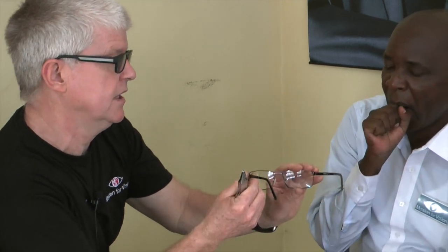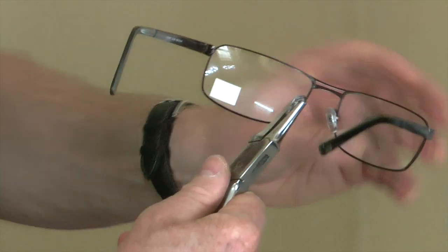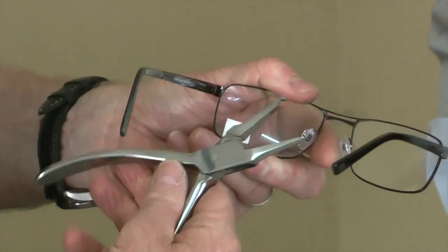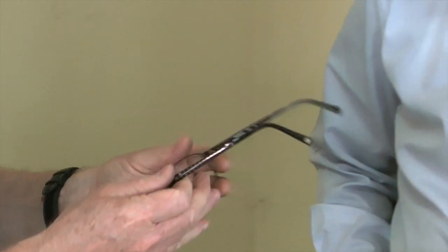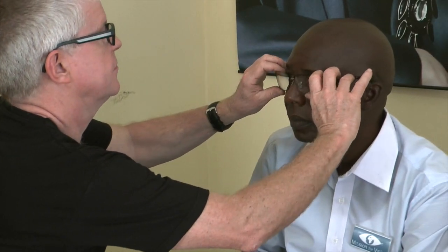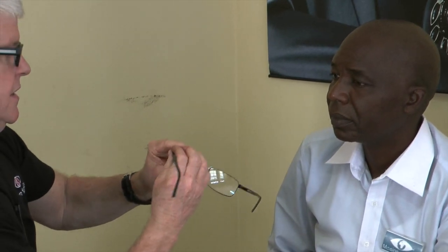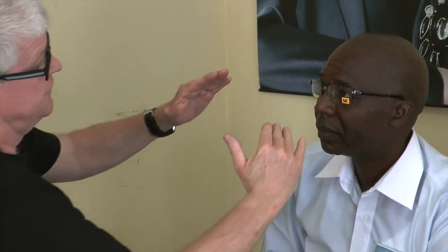So you can adjust the pad out and you can affect the angle of splay. The angle of splay is when you change the plane of the pad and you flatten it out so that it fits the contours of the bridge. What I've done with this pair is I've put the pads back and splayed them, and hopefully that combination — I need to splay them a little bit more. Yeah, it just needs a little bit more down that side. So they're fitting pretty well.